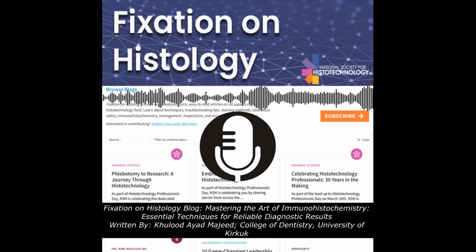Choosing the right detection system. Two main detection methods are commonly used in IHC: the avidin-biotin complex ABC system and polymer-based systems. While the ABC method relies on the strong binding between avidin and biotin, polymer-based systems use large polymers that carry numerous enzyme molecules, increasing the signal strength without relying on biotin.